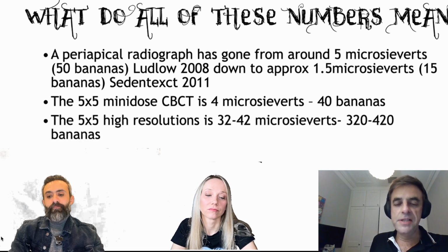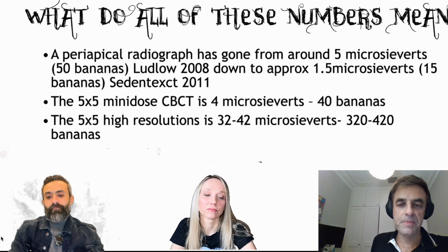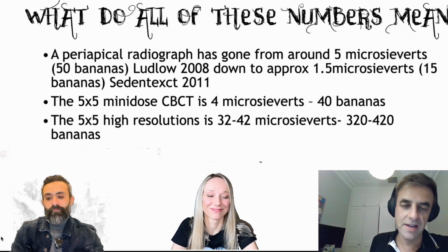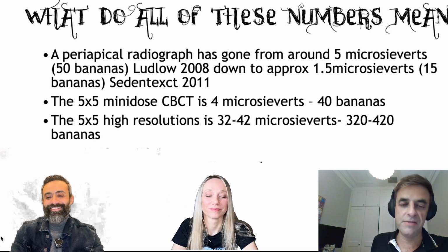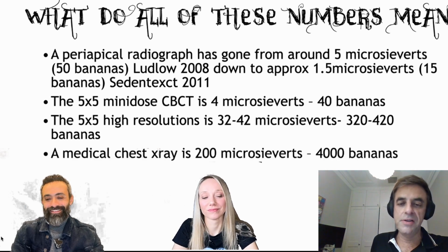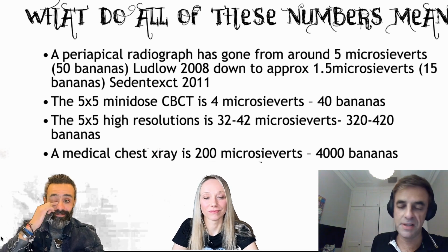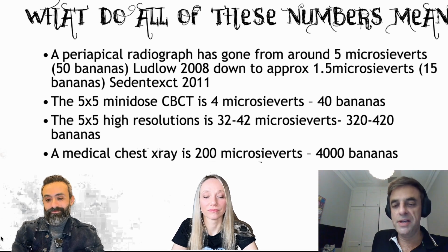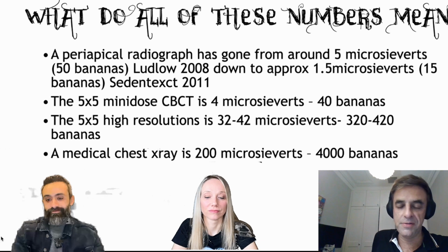Patients often say they don't want to have radiographs. And I'll say, look, it's been a big change. If you look at Ludlow, 5 microsieverts, and now we're talking about 1.5 microsieverts and 15 bananas. So we've gone down from 50 bananas to 15 bananas. And that's 2011, and obviously things have changed since then even. The mini dose is only, as I said, an old bite wing, which was 4 or 5 microsieverts in the previous Ludlow study. That's 40 bananas, and a high resolution, it's about 32 to 42 microsieverts, so 320 or 420 bananas.